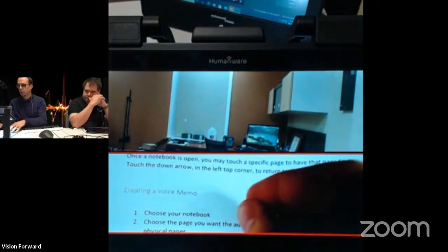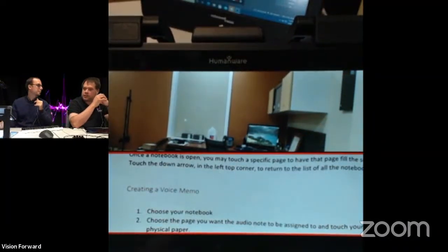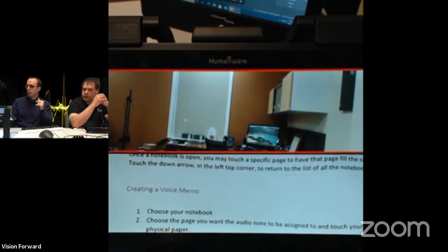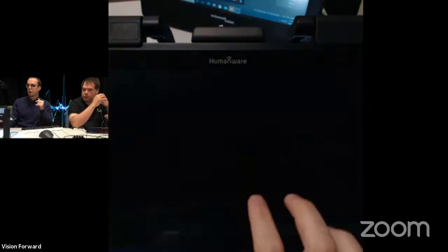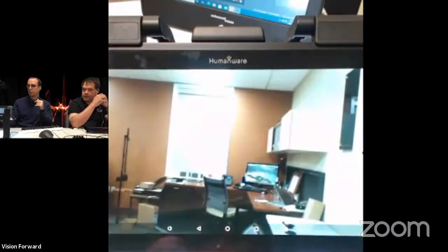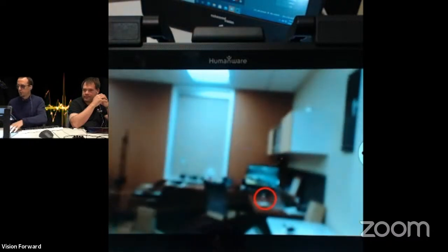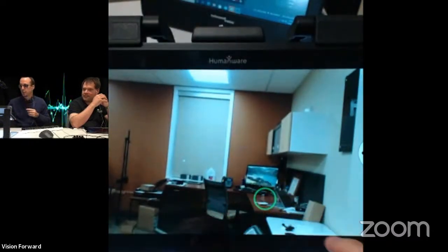So this is a really cool feature, a productivity feature. Are you able to adjust? Is it just a 50-50 split? Are you able to adjust the? That's a great question. I'm not 100% sure. I'm guessing not, because that gets pretty complicated. Yeah, it may be possible. But that's a distance mode. Very cool. It works exactly as it's advertised. It's crazy how that happens.